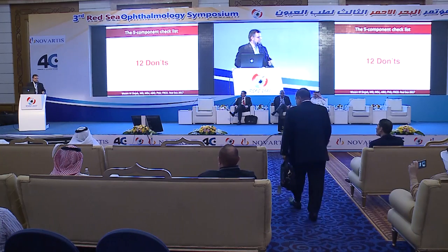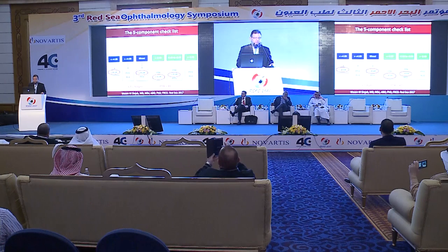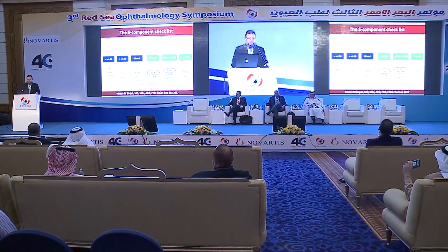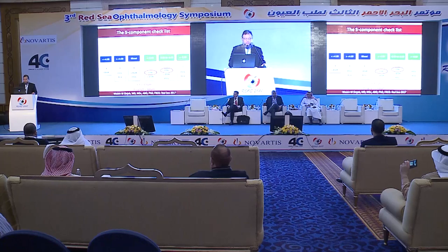Actually, there are 12 don'ts. They were 10, but today in the morning, I developed them into more because I learned from Arthur and Ala yesterday a lot of things. I don't do LASIK when the thickness of the cornea is below 500 microns and when the PTA is above 40%. I don't do surface ablation when the corneal thickness is less than 470 and when the final thickness after ablation with epithelium is less than 400 microns.